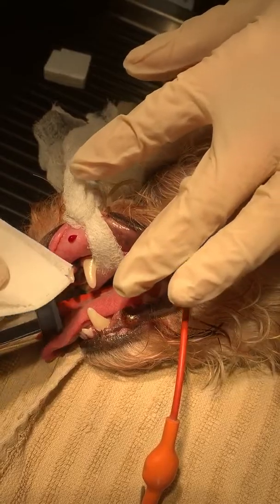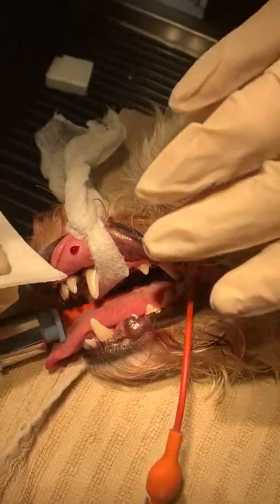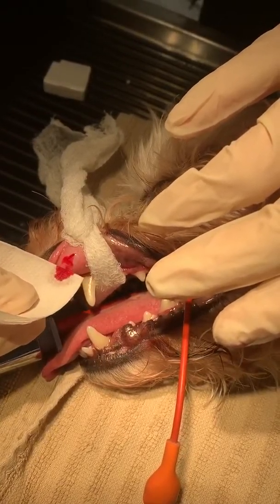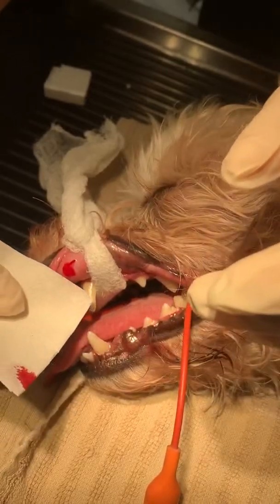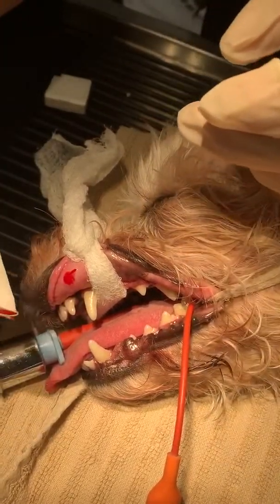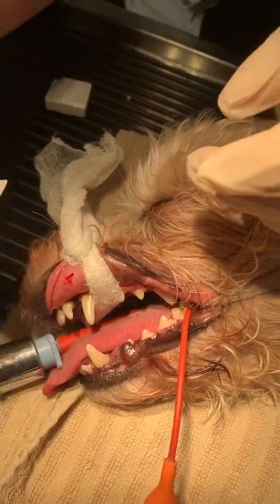To do the test here, I'm just going to blot away every five seconds or so. The trick is to not touch the incision site — we want to not be inhibiting any clotting that's happening. I'm just going to kind of dab away as it bleeds.